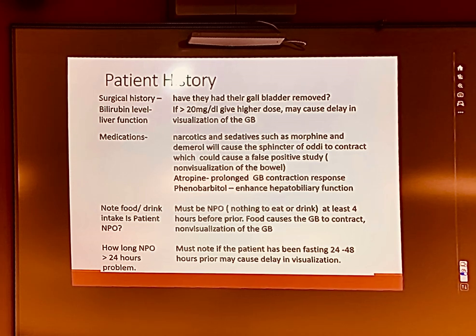Nothing to eat or drink for at least 4 hours, 4 to 6 hours, because food causes the gallbladder to contract, and if the gallbladder is contracted, it's not going to store the bile that you're tagging to be able to see. If your patient has been fasting more than 24 to 48 hours, you are going to have a delayed visualization of the gallbladder anyway.